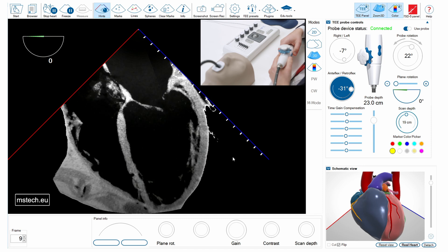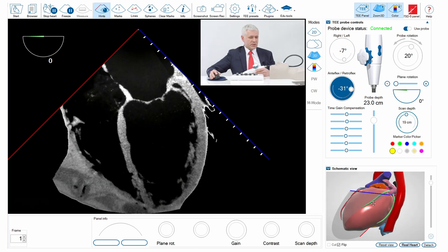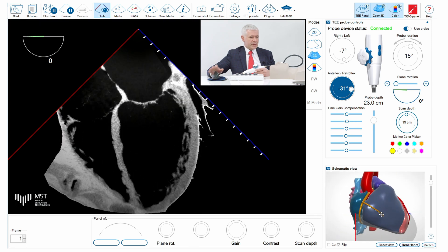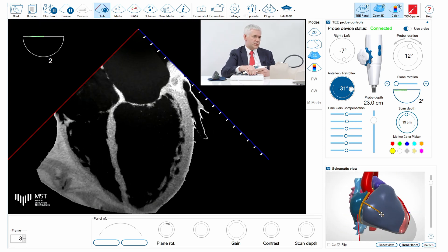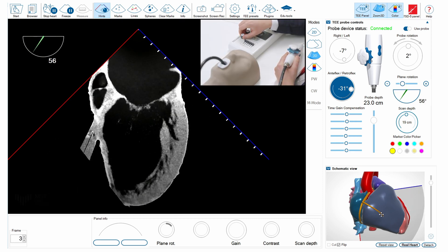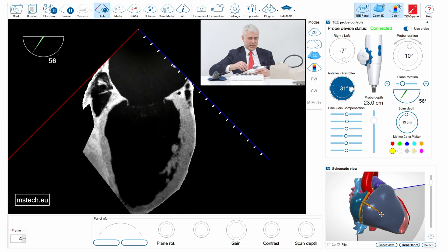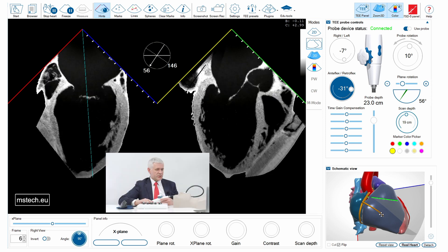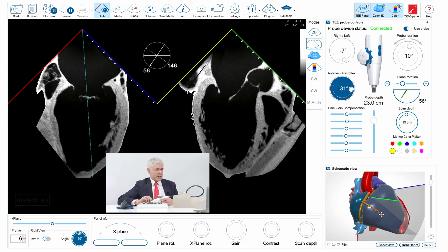I previously adjusted also the retroflex angulation of the tip of the probe, and now I can move to the intercommissural view, which is in this case about 56 degrees. Then I can switch to x-plane and show you the long axis view at the same time.